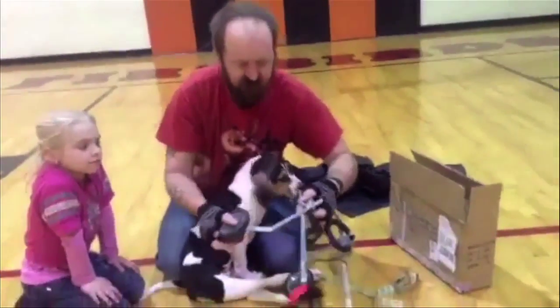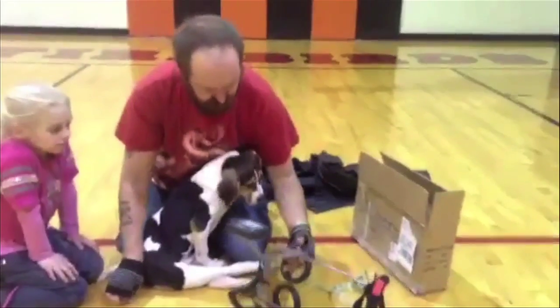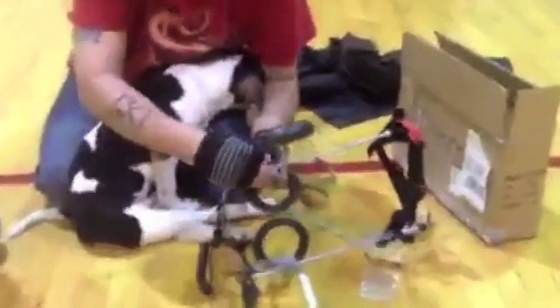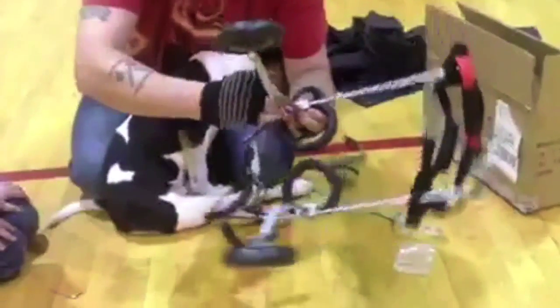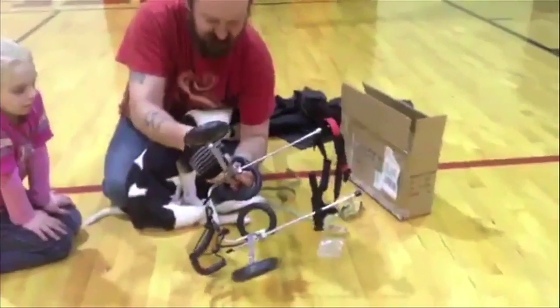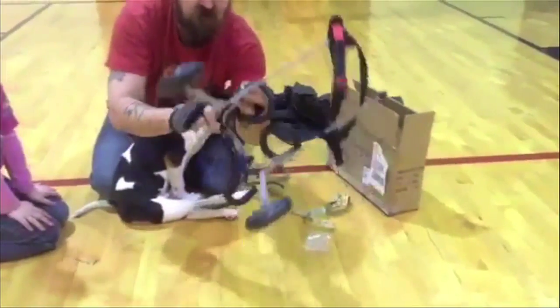You unscrew this, and the legs go up and down. And with the Allen wrenches, there's a little screw here in the bottom, makes this adjustment right here on the length of the equipment.